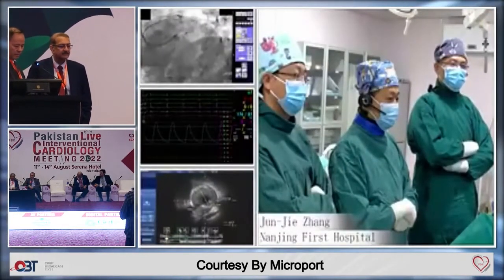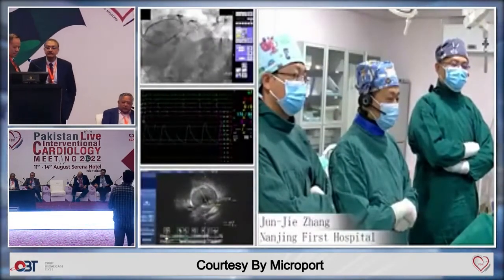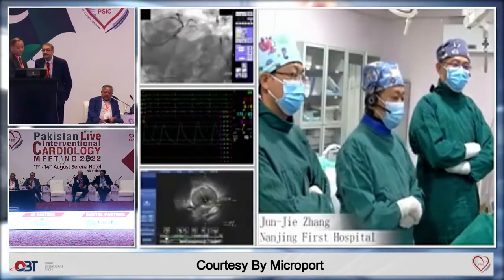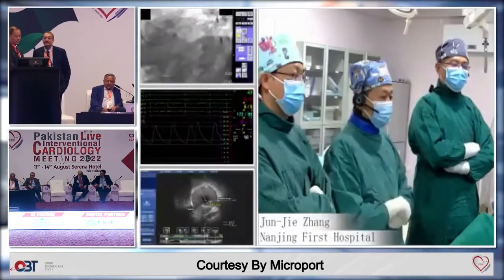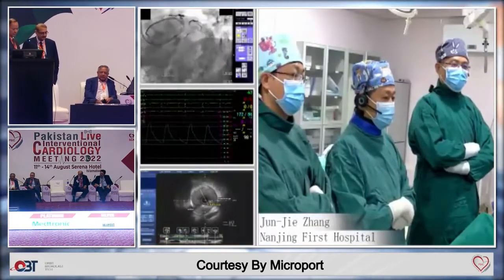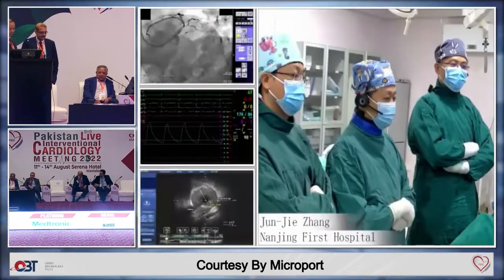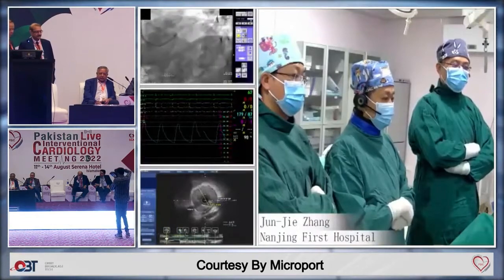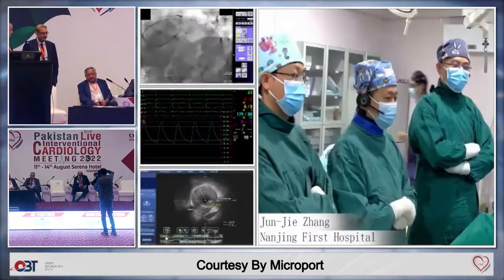I didn't see the amount of calcium, so obviously you're going to do some IVUS imaging of both branches, and if it's calcium, maybe we'll do some plaque modification. Xiaoleng just told me you may have a shockwave type of balloon in China now, so if it requires plaque modification, you could do IVL if needed before you do your 2-stent strategy. Pilar.